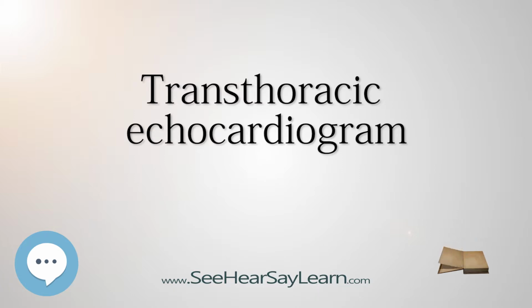With advanced measurements of the movement of the tissue with time, tissue Doppler, it can measure diastolic function, fluid status, and ventricular dyssynchrony. TTE in adults is also of limited use for the structures at the back of the heart, such as the left atrial appendage.